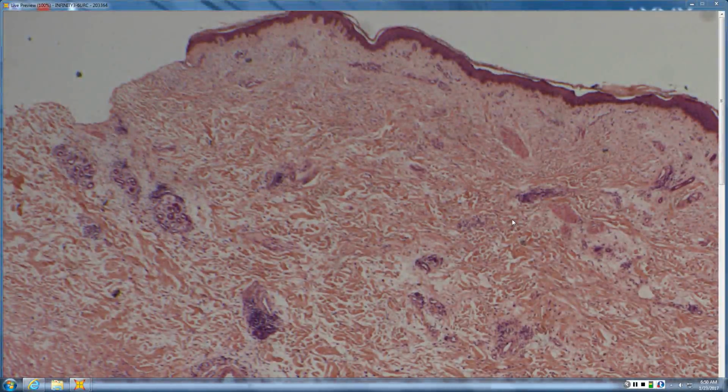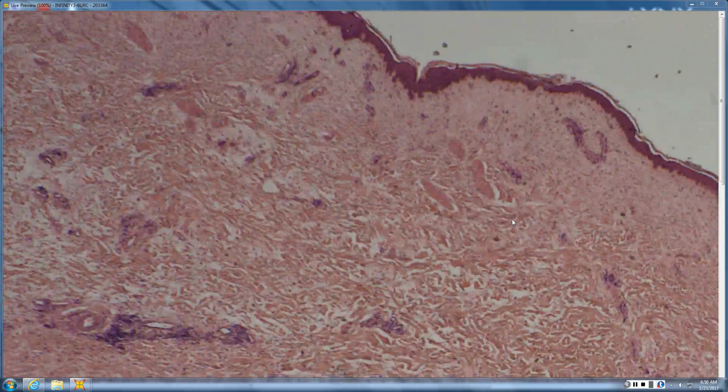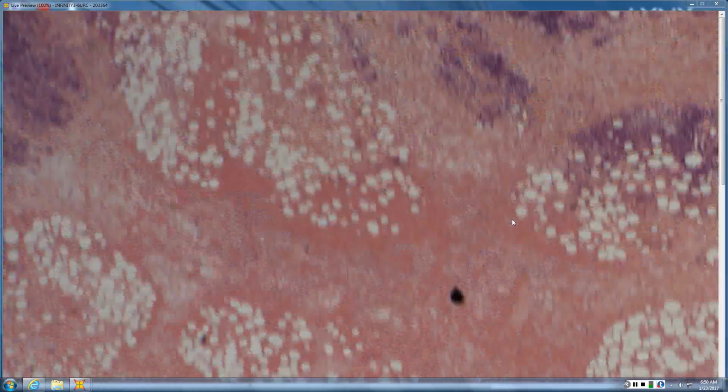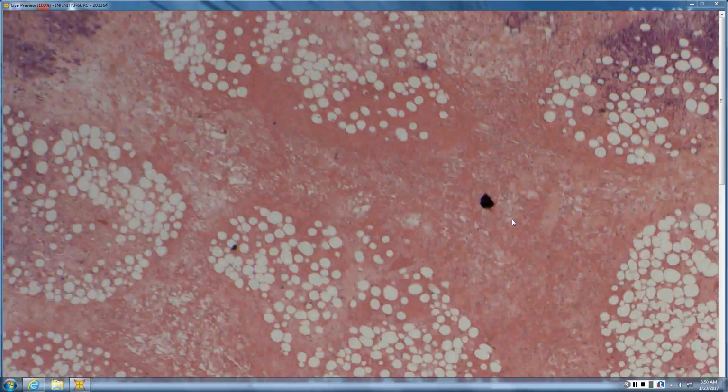So you have some clues at scan, and as you go down deeper, the lymphocytic infiltrate continues, and you can see what I was talking about where it's really not clear cut. Let me see if I can get the arrow to work. Here's some spillover of the inflammation into the septum, but if you look, it's predominantly going to be a lobular process here. This lobule's affected, this lobule's affected. This is, I think, Dr. Alston's chicken soup, I think he calls it.